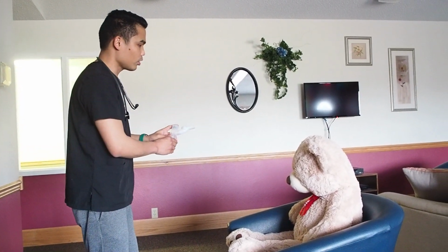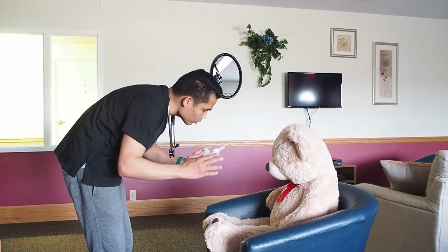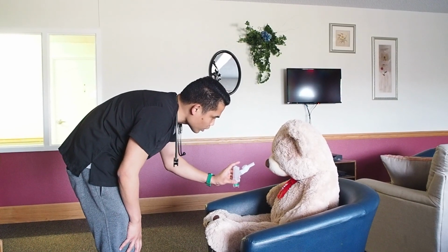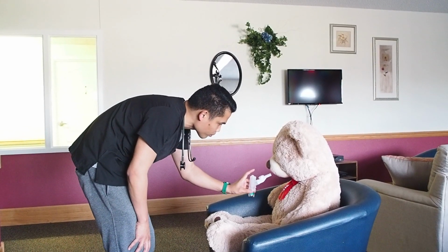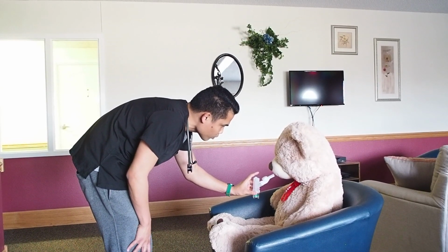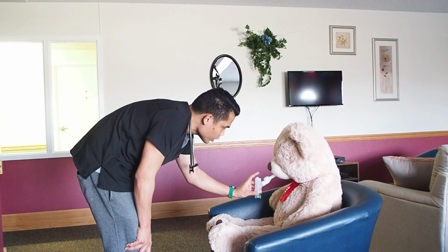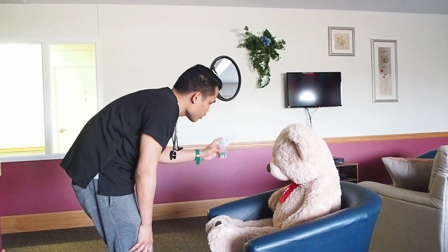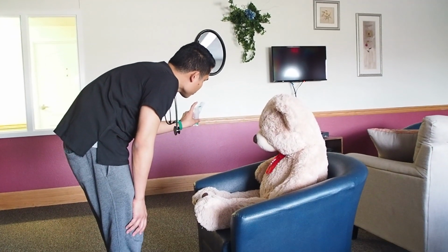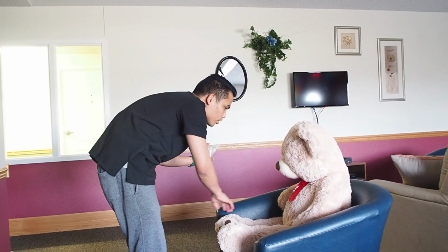Okay, so we're going to do it now. After that, you have to put this inside your mouth with your lips sealed. I'm going to guide you first so that you will be aware how to do this, and then I'm going to count 1, 2, 3 before inhalation. Okay, so I'm going to shake the device, actuate this once or prime the dose, and then exhale all your air out.